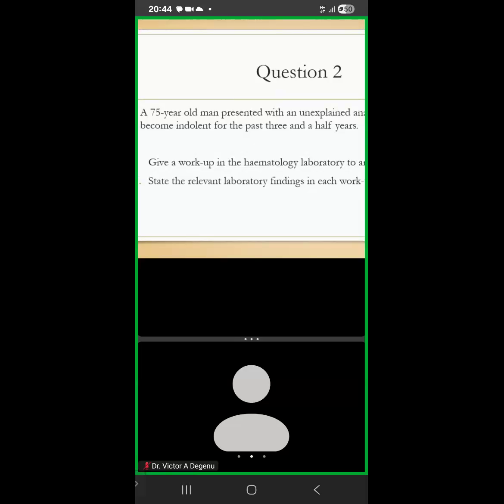In other words, it is refractory to treatment. It means you are dealing with refractory anemia, and refractory anemia is a myelodysplastic syndrome. And so that's how you begin to go through. So understanding the context of the preamble is the main thing.